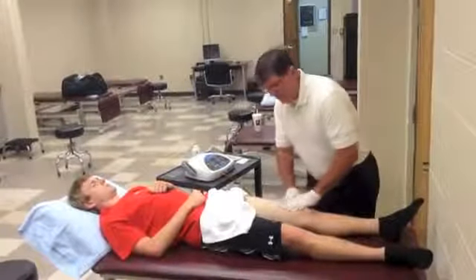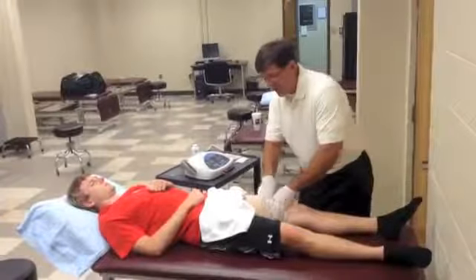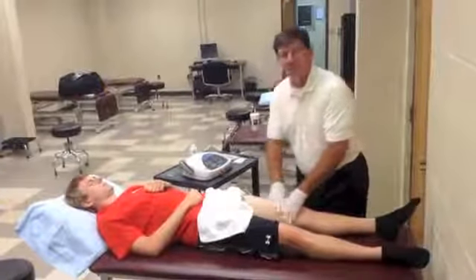It's called deep tissue oscillation. It's a combination of electrical stim and soft tissue mobilization techniques.